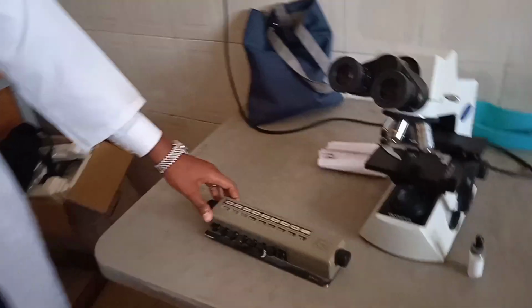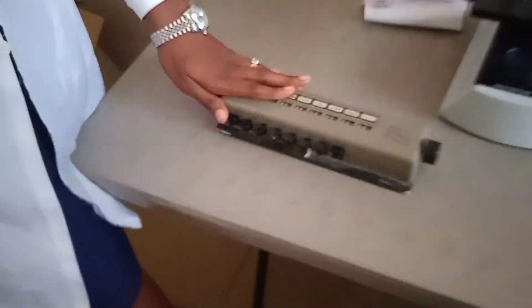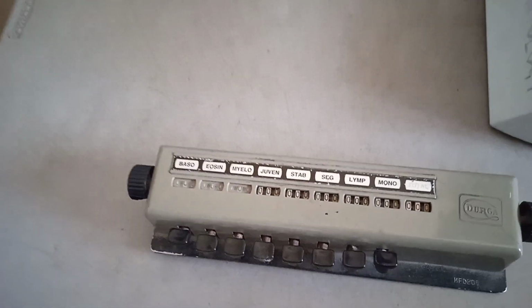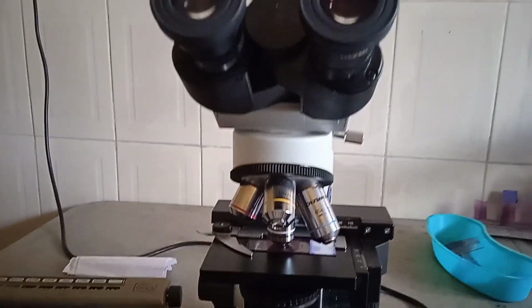And this is the cell counter. It is used for counting cells manually, that is when you do a differential count. There are different white blood cells on it, so it's actually used to count them manually.